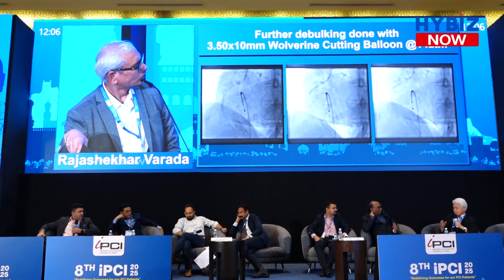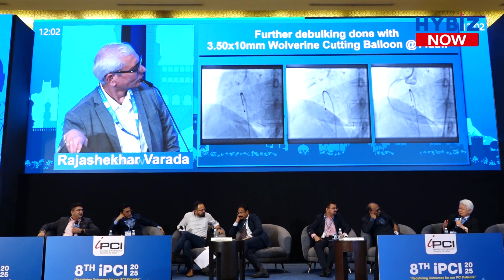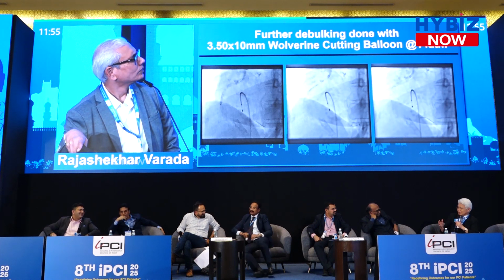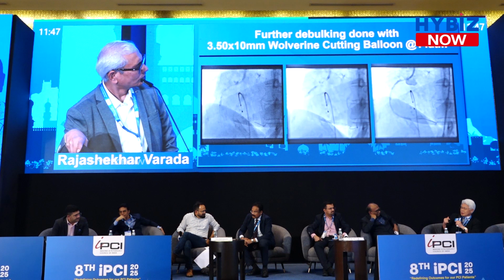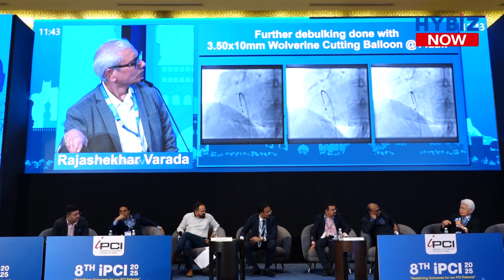Yes, at the moment in the randomized study, there is no significant difference between the modified balloon technique and rotablator or orbiter. That is the one key, right? And also, when we try to do the ablation using a rotor or orbiter, the position of the calcium and wire bias is very important.